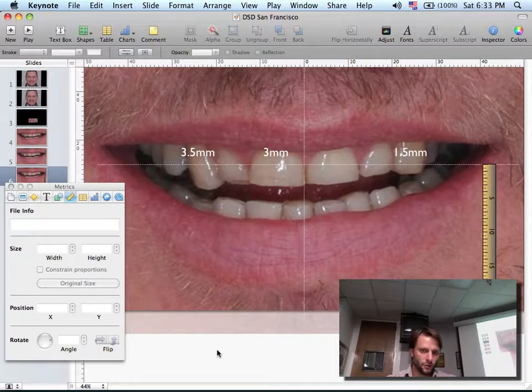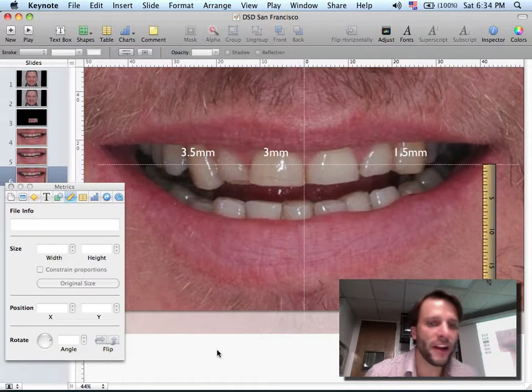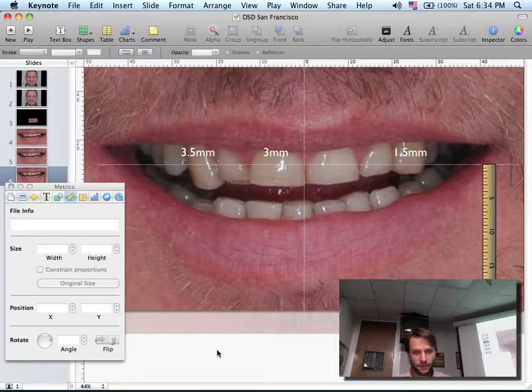Okay. So the buccal of the 6 anteriors, I will only be guided by these lines, so it doesn't matter if the face bow is off or not. I will make sure that the lines are guiding me. If I'm not using a face bow, I will use the mounting plate. Then I think it's better, because I will get the upper model, and before mounting, I will make the marks, draw the cross, and wax up the buccal of the 6 anteriors, making sure the incisal edge is leveled with the cross. Then I will place it on top of the mounting plate, so I have the 6 anteriors to guide me on this mounting, so I can position exactly the way it's right, and then I will mount the upper model against the mounting plate.